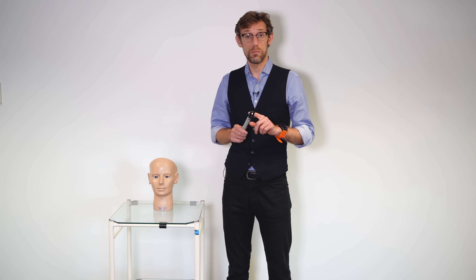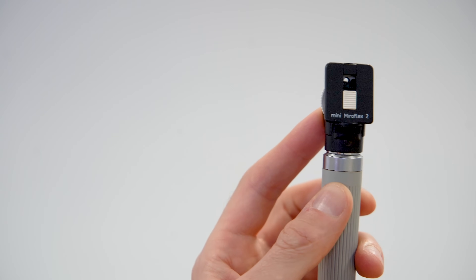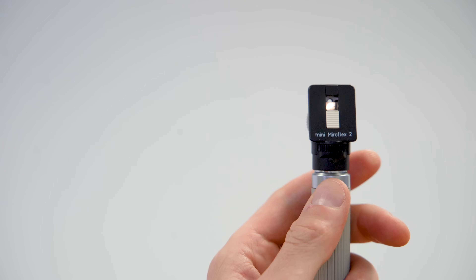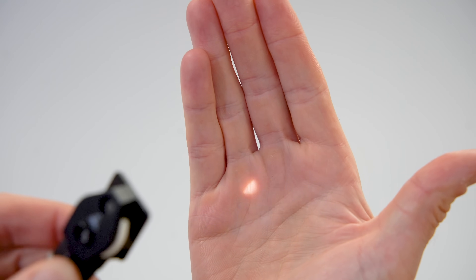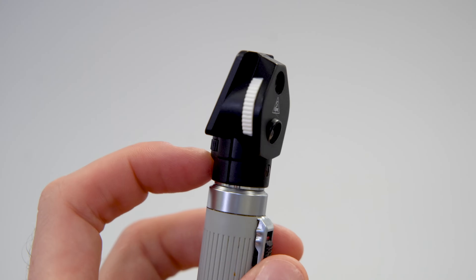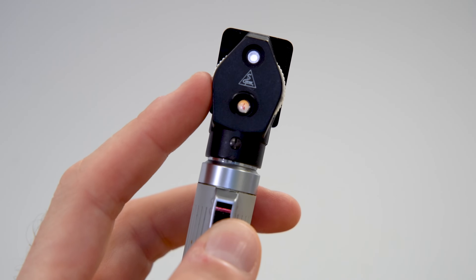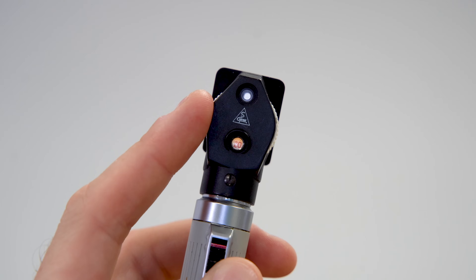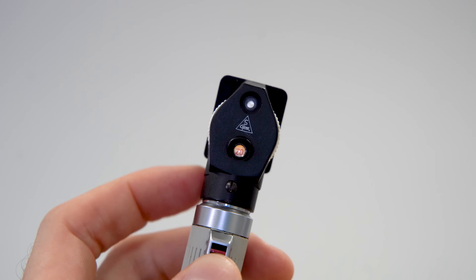We've got a couple of batteries powering a bulb that bounces through a mirror and a lens. On the front of the ophthalmoscope we've got the shutter which we can move down. We can switch it on at the back to give our light. There's a dial at the front which changes the different apertures, and on this side there is a white dial which allows us to set the magnification of the lenses, which we can see through this window. At the top is the ophthalmoscope itself that we'll be looking through to check the patient's retina.